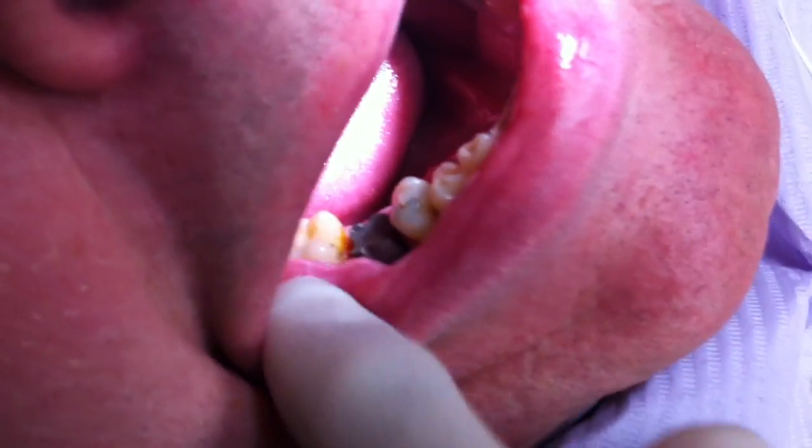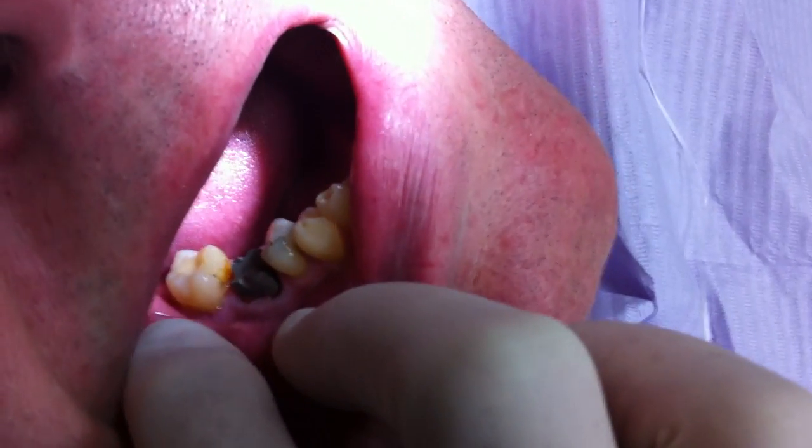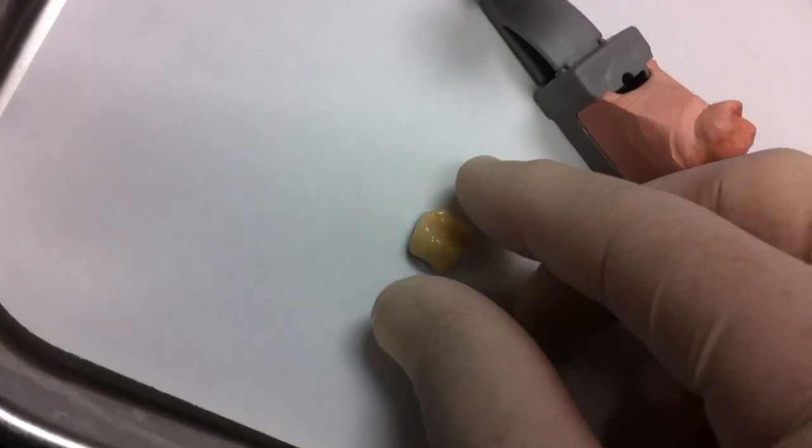There you go — now it's in. That was a bit tricky trying to do it using the camera. That's what it looks like in the mouth — the post core. And here's the crown that we're going to insert.